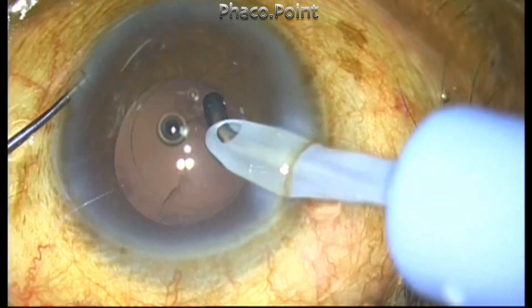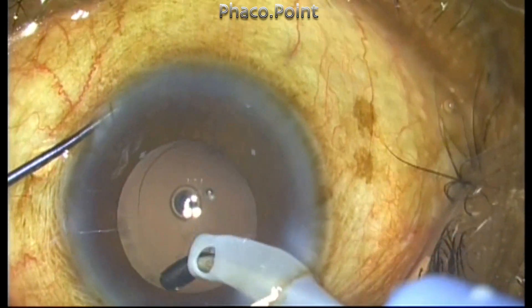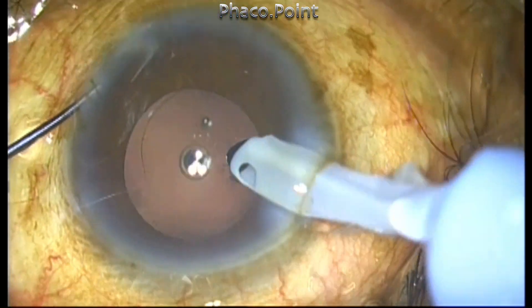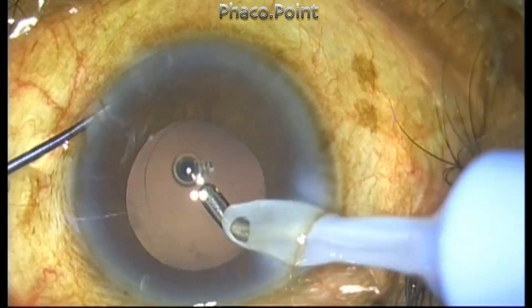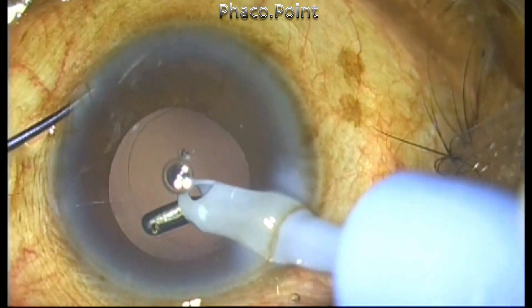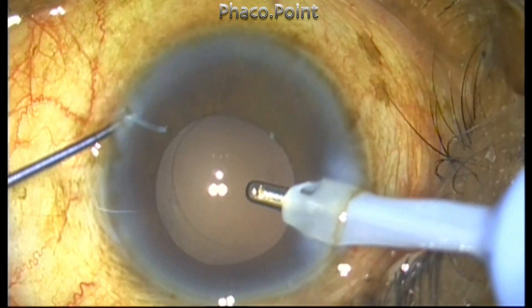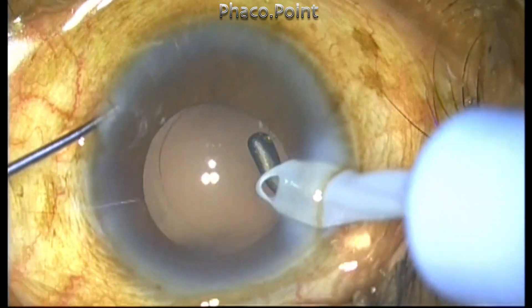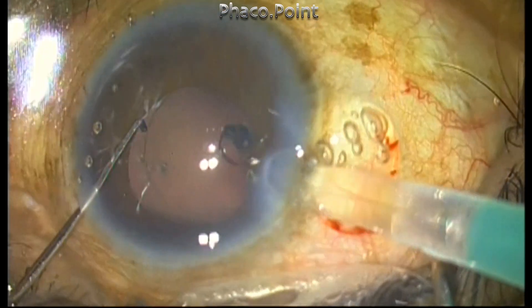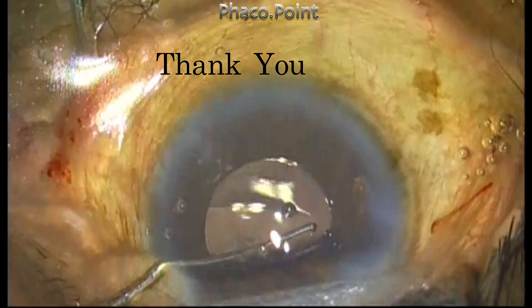The message here is that FACO fluidics and dynamics gives you a lot of advantages and is extremely superior. Most of us use the FACO fluidics and vacuum in a very minimalistic fashion without taking advantage of the full capabilities of irrigation flow rate. Learning to use the flow rate and vacuum optimally during your FACO technique is going to help you in certain troublesome situations and will help you get the maximum out of your handpiece and your FACO machine. Thank you for your attention.